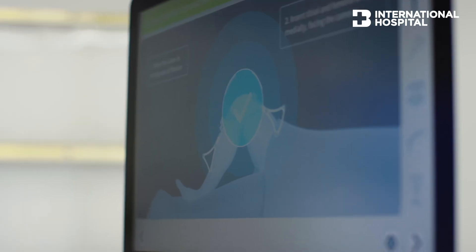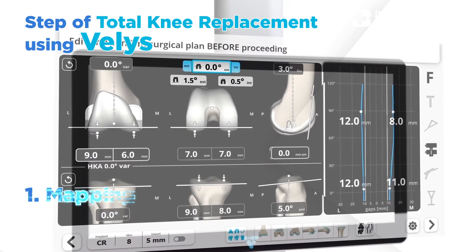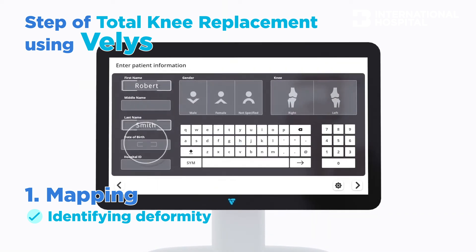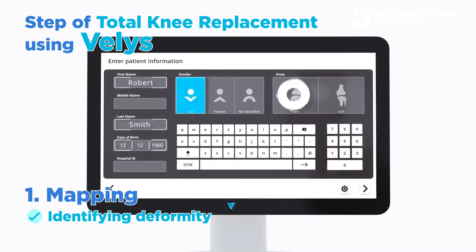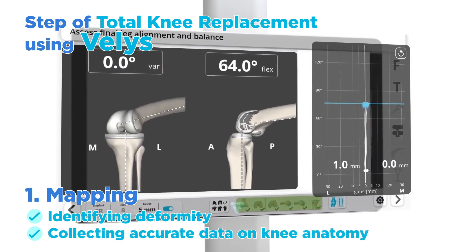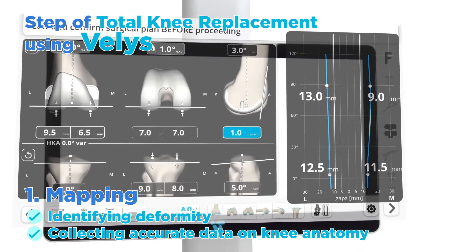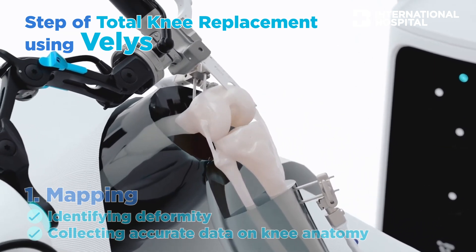We start with the incision, then we proceed with the mapping or morphing. The robotic system helps us to identify and locate the deformity of the bone. Because each patient has different bone morphology, the robotics can help to collect the data points — normally the system can collect around 2,000 data points in each knee, helping the surgeon plan the bone cut according to each patient's bone morphology.